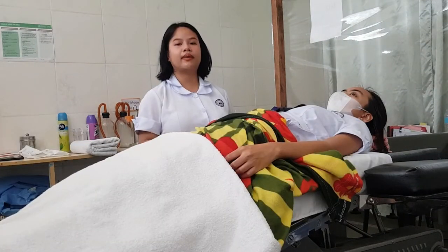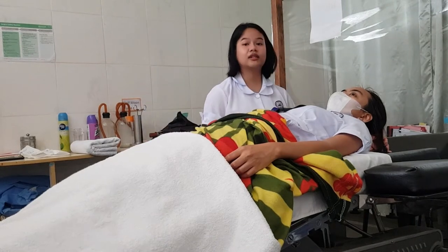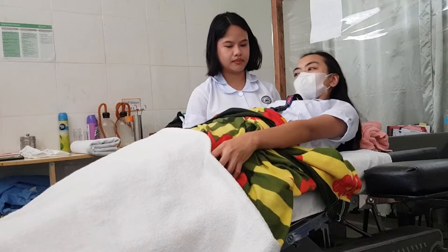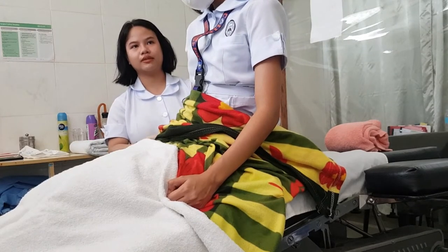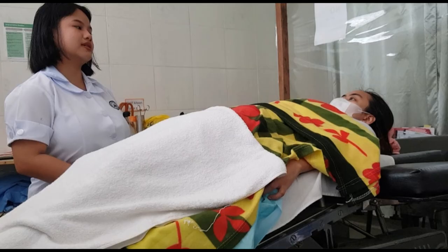After serving the bedpan, I will raise up the head of the bed to 90 degrees, or the High Fowler's position. Since the bed is not in good condition, I ask the patient to sit. Let the patient stay in an upright position until she's done. When the patient is done, it's time to lower down the head of the bed or put it back to what it was before the procedure.